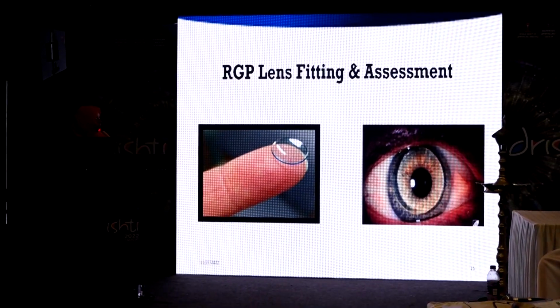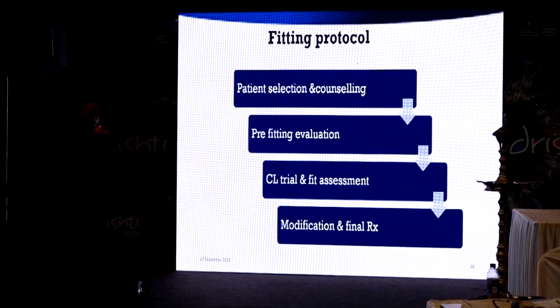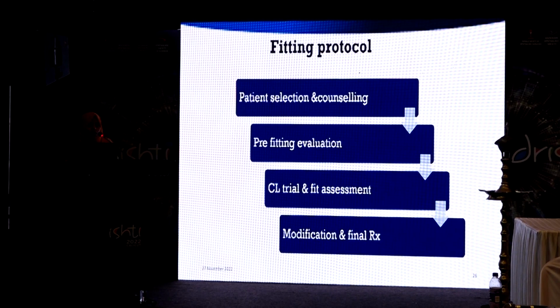Next, I move on to the RGP fitting and assessment. The fitting protocol is the same as for soft contact lenses, but in addition we have counseling, because a hard lens will take time for the patient to adapt. So we have to counsel the patient before fitting RGP lenses.